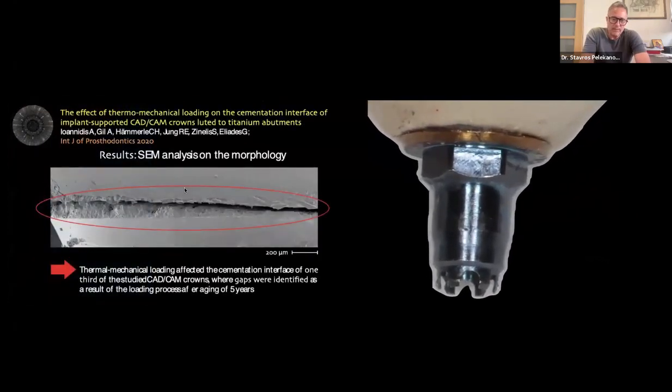And we know very well from University of Zurich and my Greek friend Alexis Ioannidis and the work from Zurich University together with my friend Ronnie Jung that after mechanical loading, this gap between the zirconia and the tie base is not always ideal.